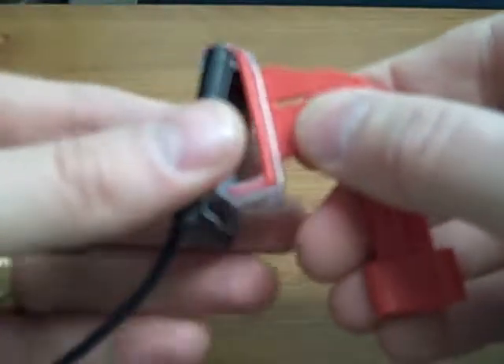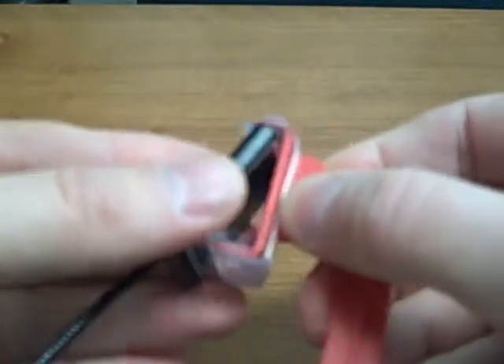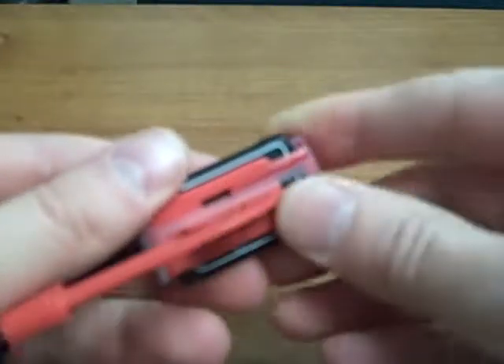So let's go on to a horizontal bite wing. Here you can see the size 2 Progeny in a horizontal bite wing. The same bite block will also hold a size 1 sensor for a horizontal.